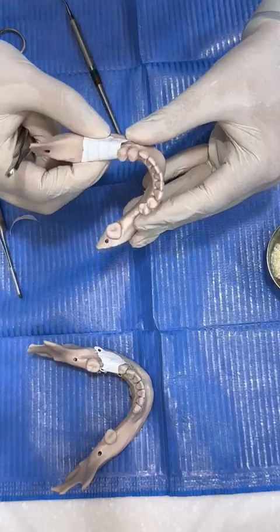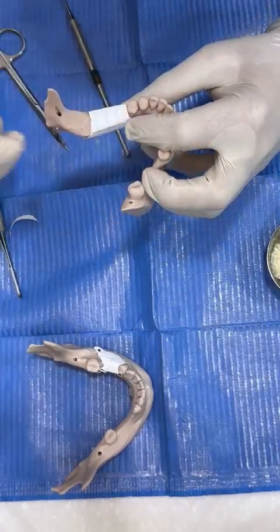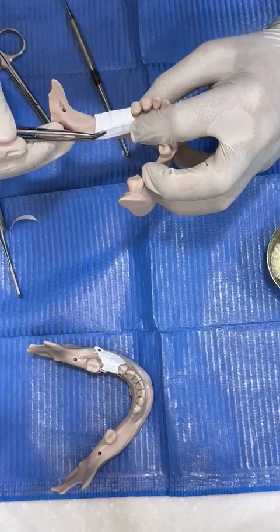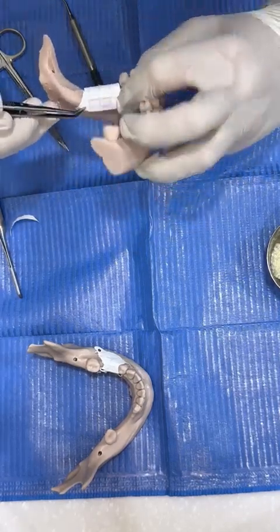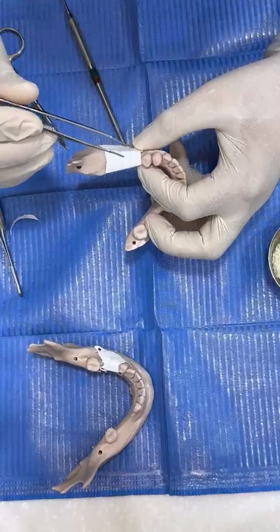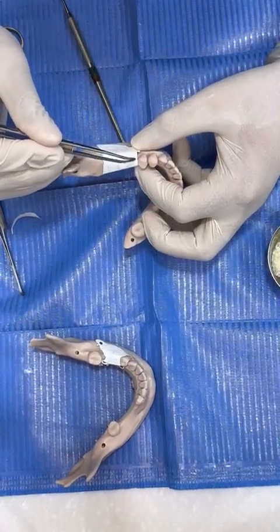Okay, now there are many ways to start the fixation. Either your assistant holds the membrane in place while you fix this part, or Istvan Urban was using a temporary pin here.